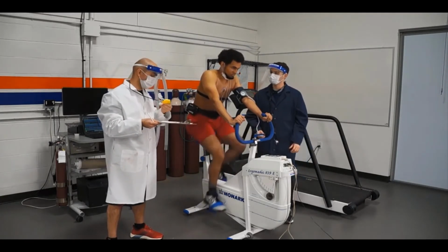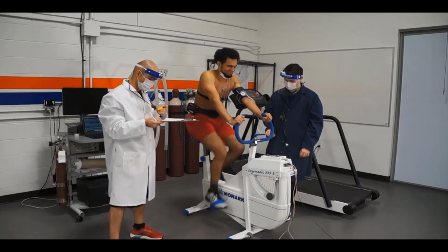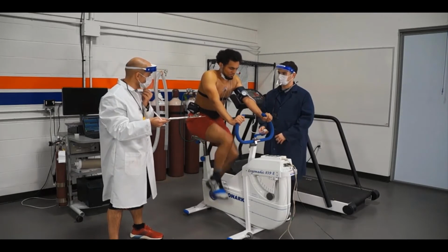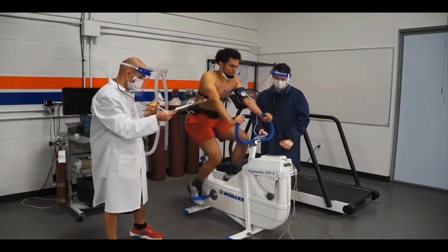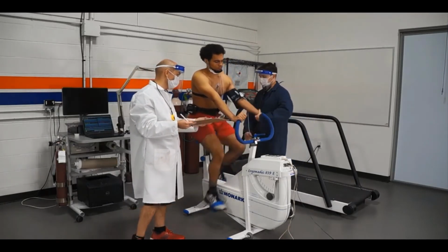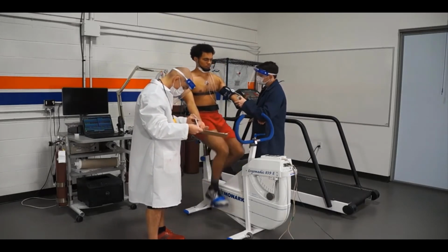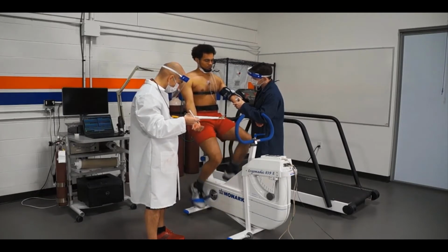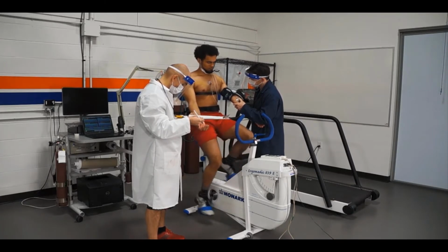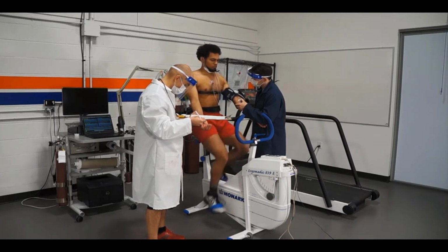Towards the end, you'll have to encourage a participant to keep going. On a cycle test, where you have a set wattage, and let's say you've designated a set amount of KPs, you have to make sure that they're maintaining their given RPMs. On a treadmill test, if you're doing an indirect treadmill test, as long as they're on the treadmill, they're maintaining. On a bike like this, where it's automatically braked or electronically braked, he can pedal at any RPMs, and it'll automatically adjust the wattage to ensure that he's got the appropriate load. So really, as long as his feet are moving, I know that he's pedaling at the watts that I've set it at, similar to a treadmill.